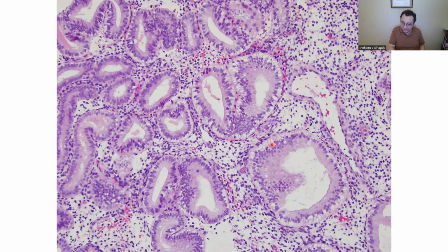No, the glands here are dilated actually because of this. See these secretions? They are dilating these glands. And you have these secretions, which we call subnuclear secretions. The subnuclear secretions make the epithelium look like piano keys. What about the stroma? Loose, edematous stroma. Good job. That's what we see in secretory phase.